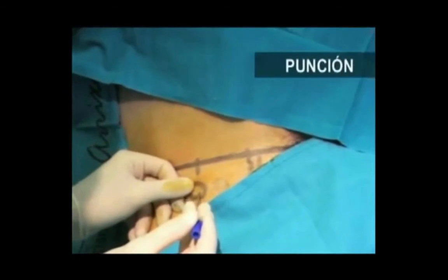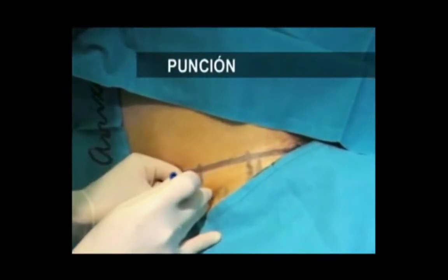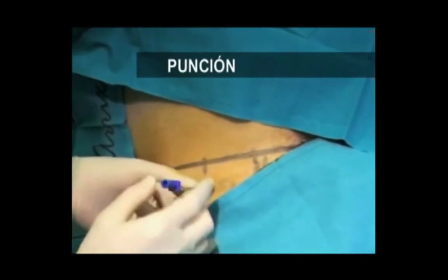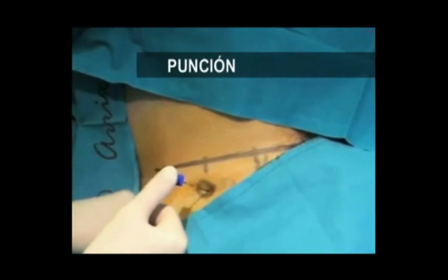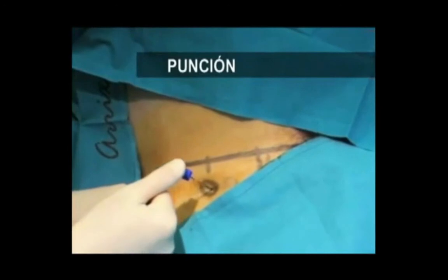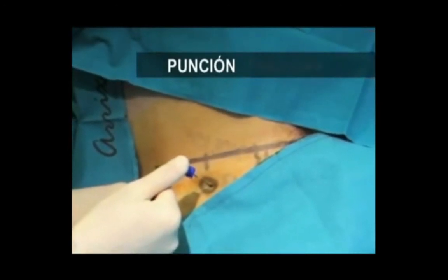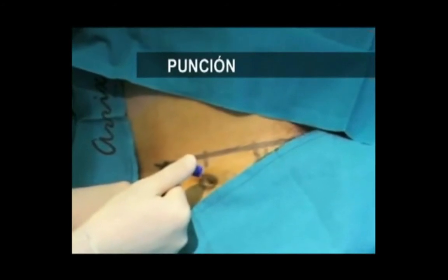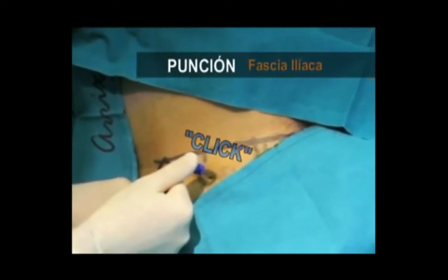So what they're very careful to do here is just make sure that they get through the skin before they start advancing and counting the clicks. Now, the clicks they're going to feel are the fascia lata and then the fascia iliaca. So you can see 2 fairly distinct pops there.